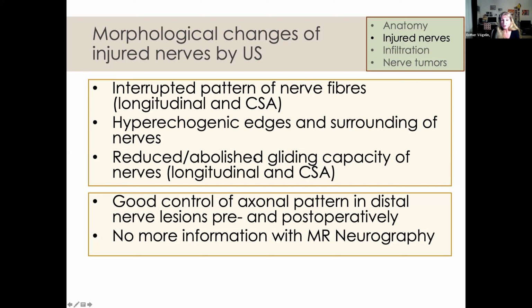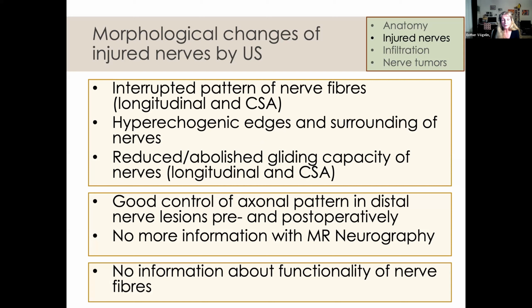You have a good control of axonal pattern in distal nerve lesions, pre and post-op, but I think you have no more information with MR neurography in distal nerve lesions, as I mentioned before. And don't forget, you have no information about functionality of nerve fibers.